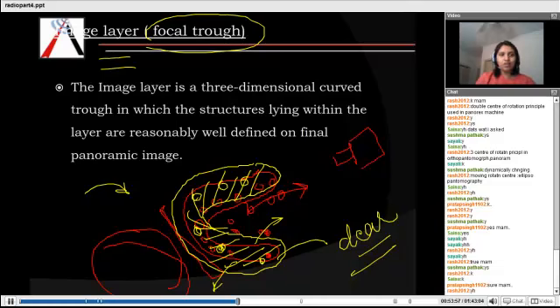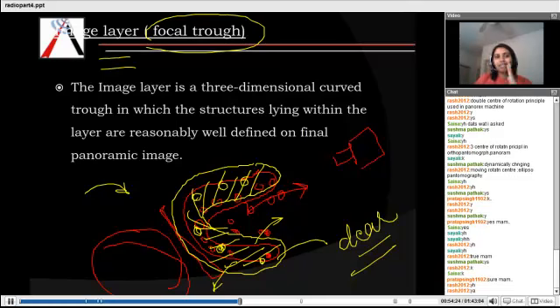Clinical scenario. In the diagram, you see your mandible moving snugly with the image receptor in this representative diagram. But imagine the scenario in the clinical case. The image receptor does not move while stuck to the patient. The image receptor has a little distance from the patient when it is moving around the patient. Isn't it? We cannot have the patient's cheek or mandible fixed to the image receptor, the way we are talking about in our diagrams to understand it.